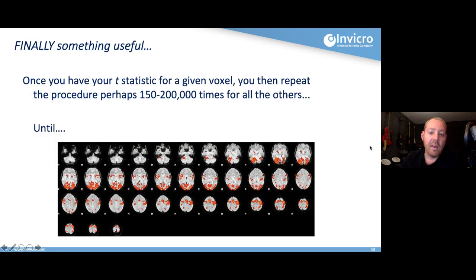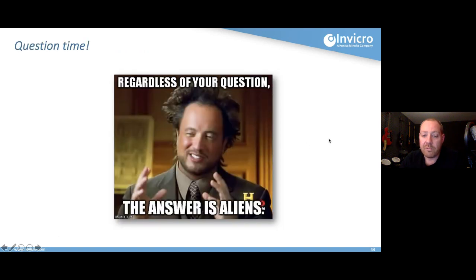Yeah. So once you do that maybe 200,000 times, you then end up with your lovely, pretty coloured brain maps. Something useful, finally. Oh, I'm dreading the questions on this one.